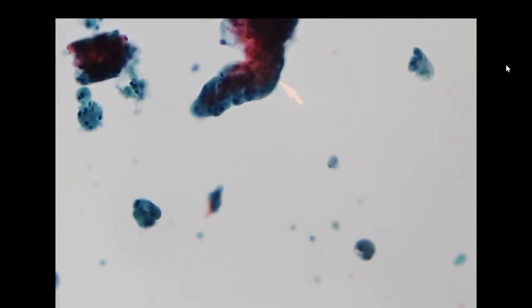In this specimen, we do see some cells, and it seems to be cystic because we see some material as well as histiocytes in the background. When we go to higher power, we do see that these are histiocytes, and we have some atypical cells in clusters.